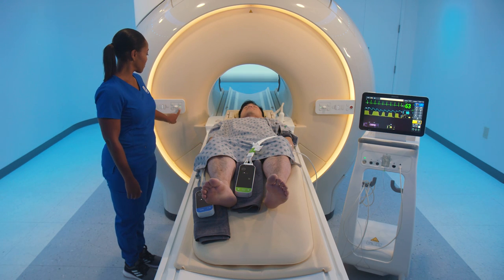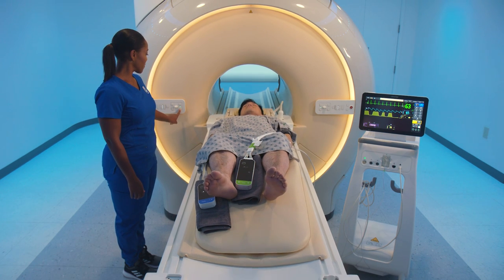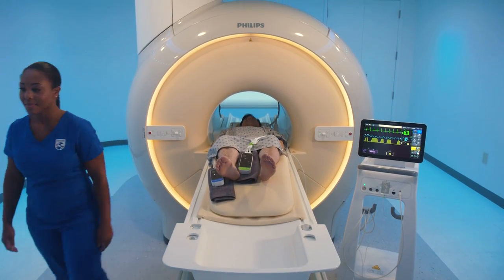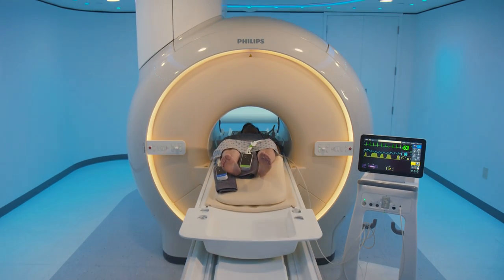The purpose of this video is to provide a clinical applications overview of ECG gating using Philips Expression MR patient monitors.